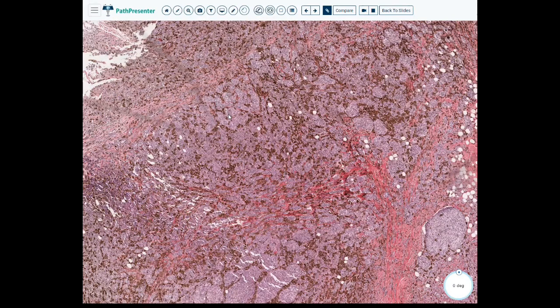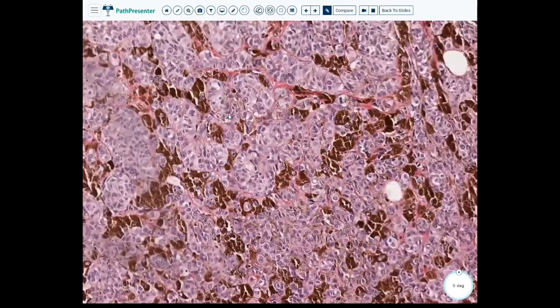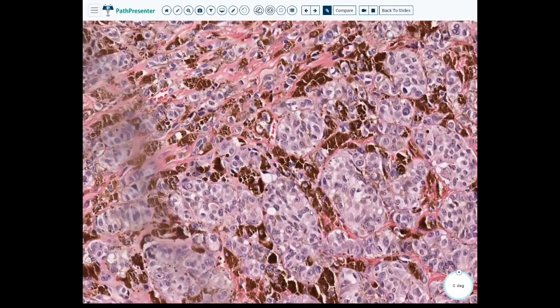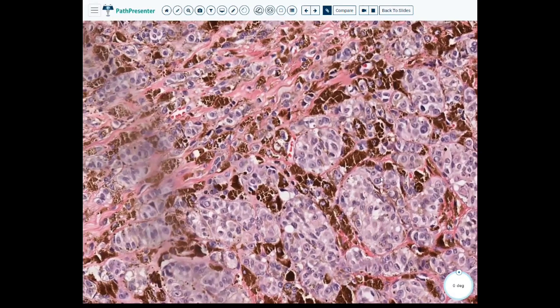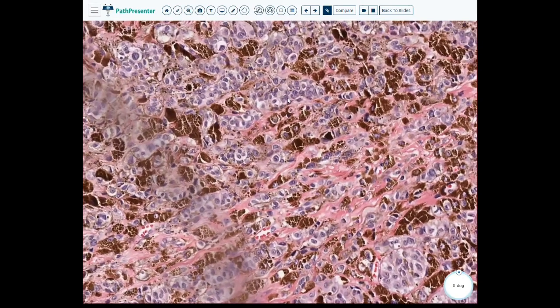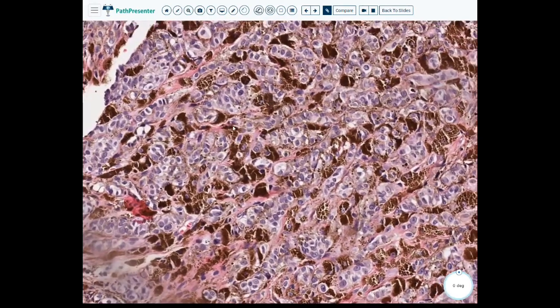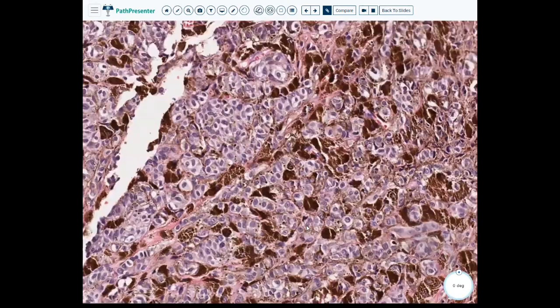areas of melanocytes, but the melanocytes should be more spindled. They should have those dendritic processes, and this almost, like, they're large, they're plump, they have these macronucleoli. I'm not necessarily really appreciating a lot of like mitotic activity, but this is, I think, worrisome.